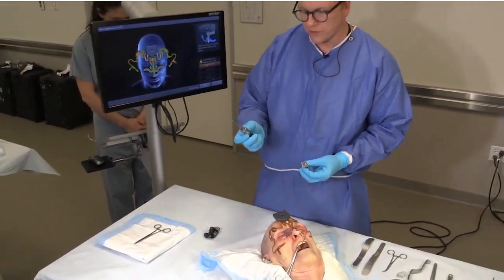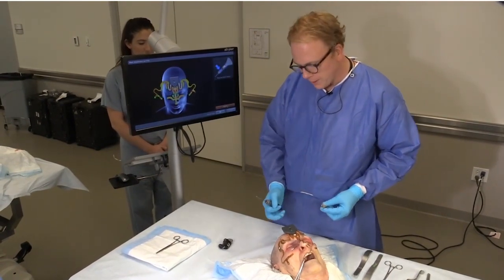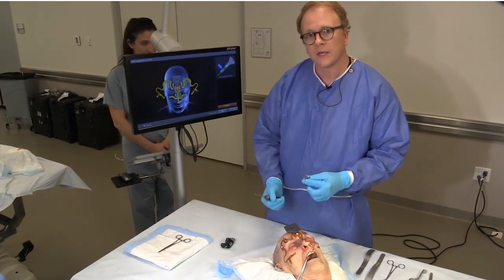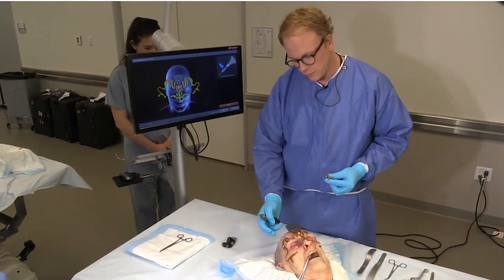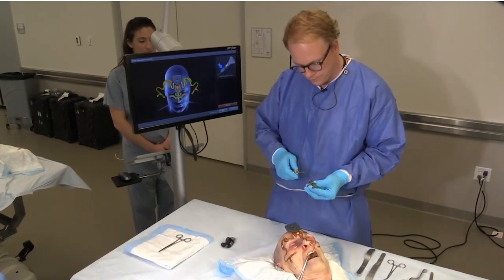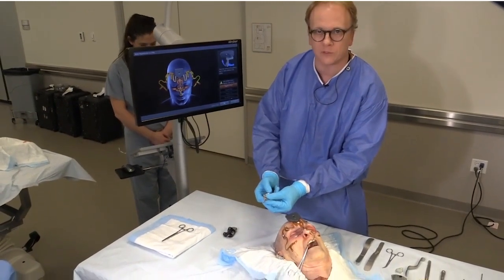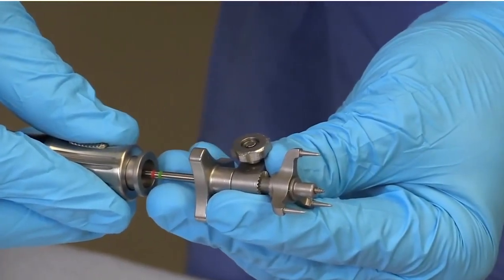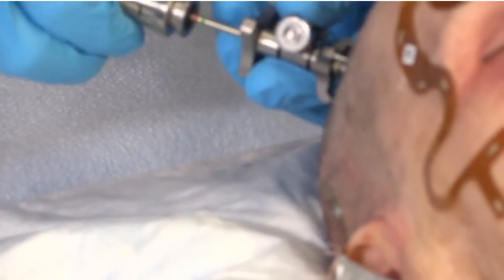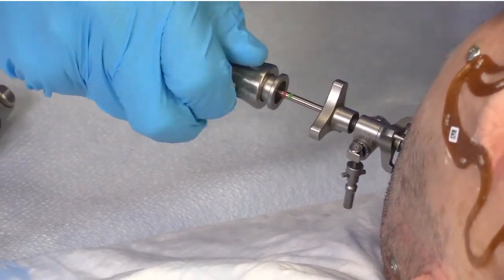This is going to be affixed to the skull with a single 2.0 screw, 6 to 8mm in length, drill-free. You can put this on after the coronal flap is elevated, or prior to it — in which case you'd make a little nick in the scalp with a 15 blade, go right down to bone. Then the screw inserts down the middle tunnel and comes out of the post, just like this.